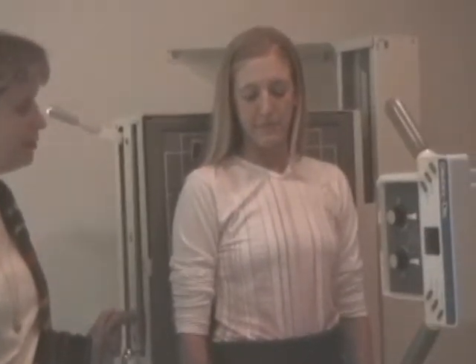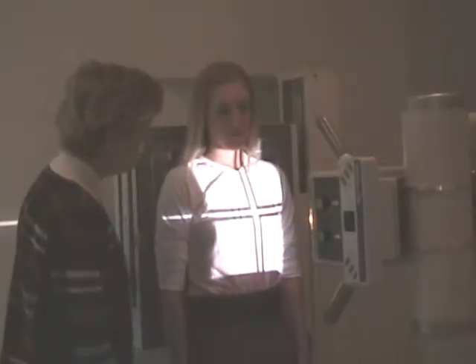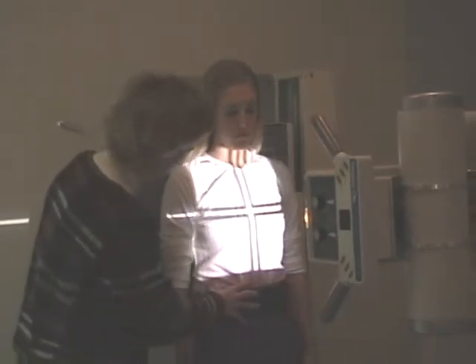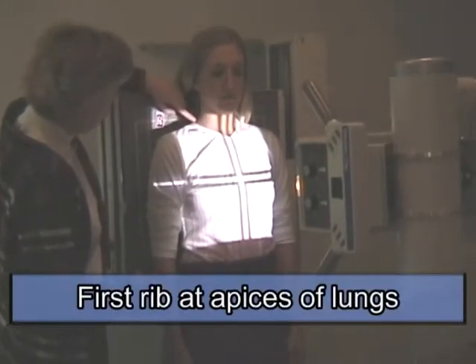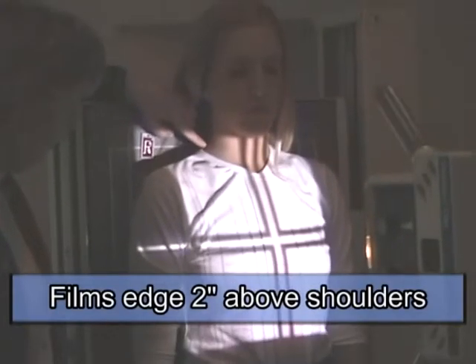Kristen is a walkie-talkie patient. I'm electing to do it at the vertical board. She's not a very large patient by any means, so I'm going to go with the pure positioning routine, and that's we're going to put her mid-sagittal plane to the center of the film, and the very first rib is up here at the apices of the lungs, so I want the film's edge 2 inches above her shoulders at this level.